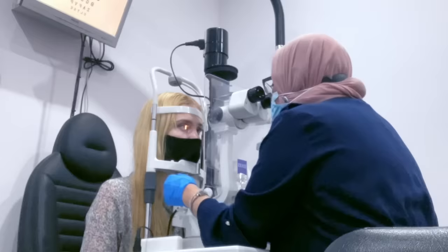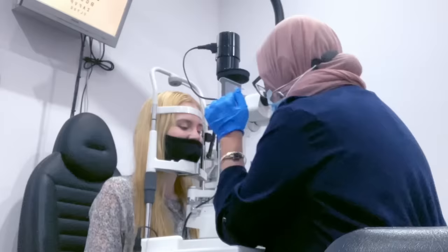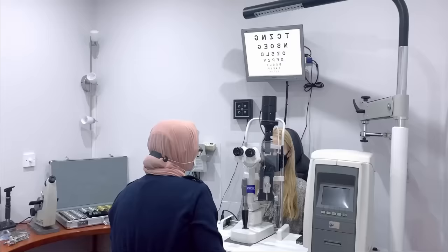When I touch you there, is there any pain? No. It's all comfortable, yeah? Good. And then when I do that, is that comfortable as well, yeah? Okay. Sit back for me. So the front of the eye looks very good, actually. It's quite nice. Okay. So I'm now going to do something called your eye pressure.